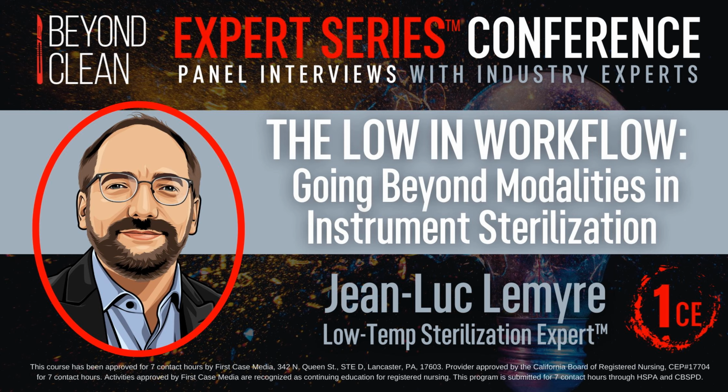And that's the first phase, and there's always at least one repetition of that sterilization phase that provides a safety margin to the process. So in a nutshell, that's the sterilization for you. And at the end of it, we fill the chamber with air, and then evacuate one or a few times depending on the model to try to remove any residual sterilant in order for the device to be safe to handle and get to a patient.